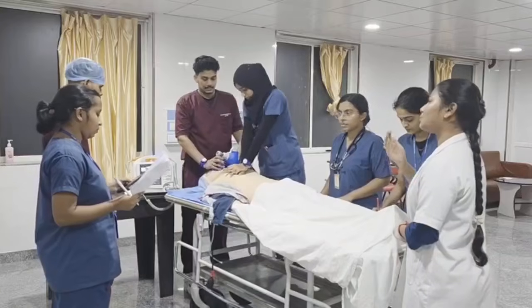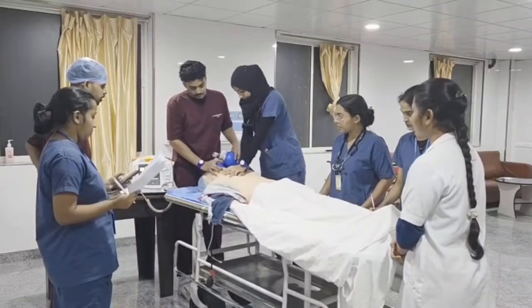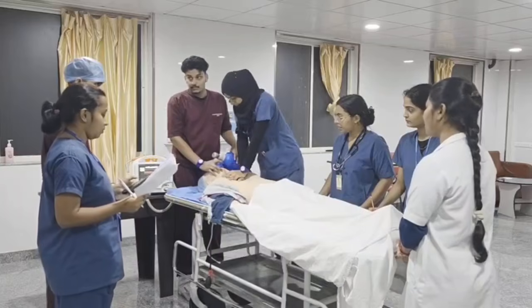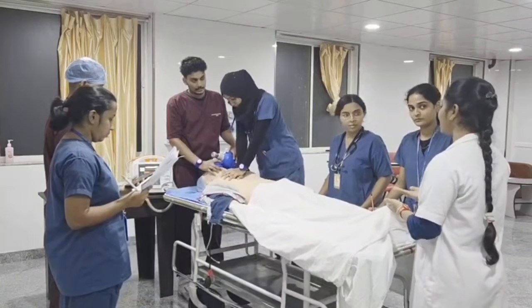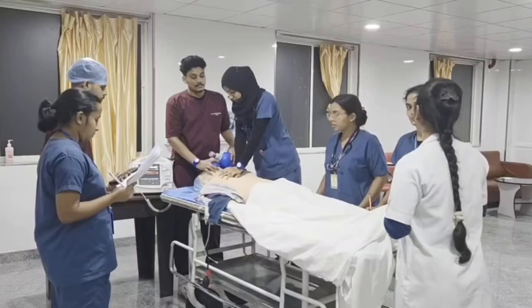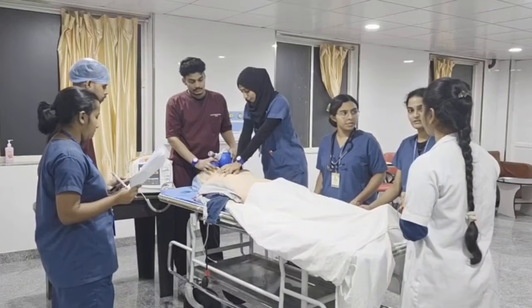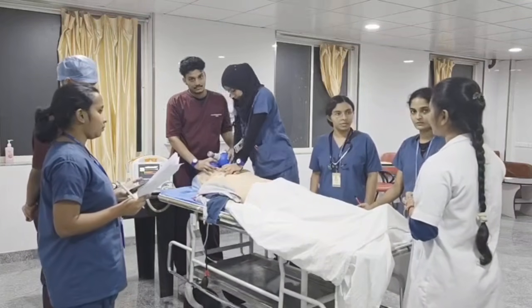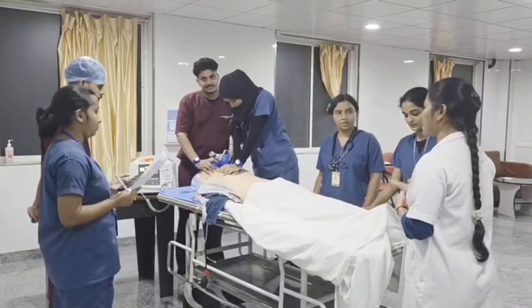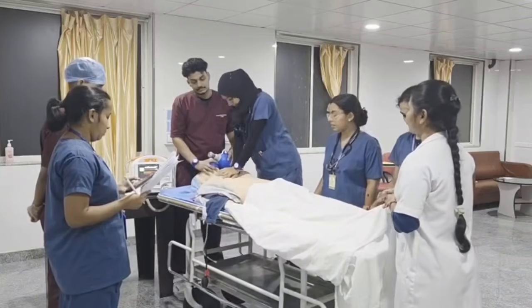And CPR coach, could you monitor the quality of CPR continuously? The quality of CPR is good, continue. Okay. Team, what do you think might be the cause of this cardiac arrest? I think the patient recently had a PCI and a coronary intervention. It could be coronary thrombosis. Okay, then once the resuscitation has been completed, we can think about a coronary intervention later.